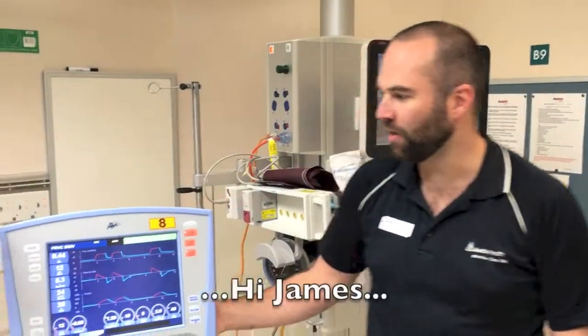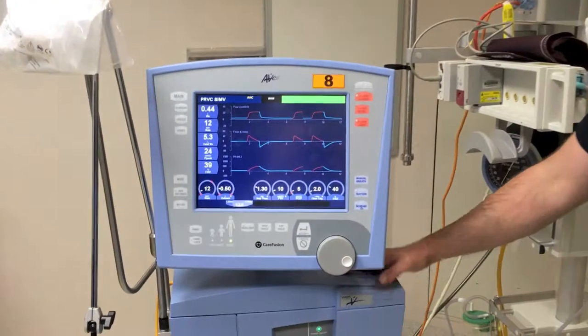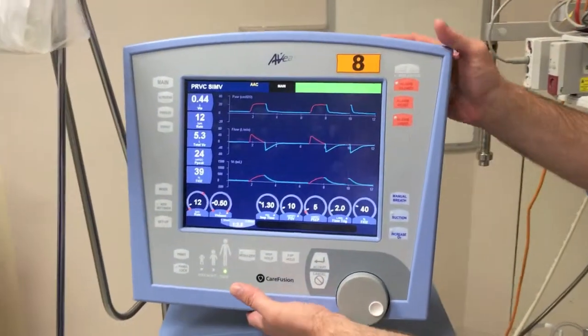Hello, today I'm just going to show you about one of our ventilators, our old style ventilators. This is Avea. Avea's got a screen that can move on and pivot.